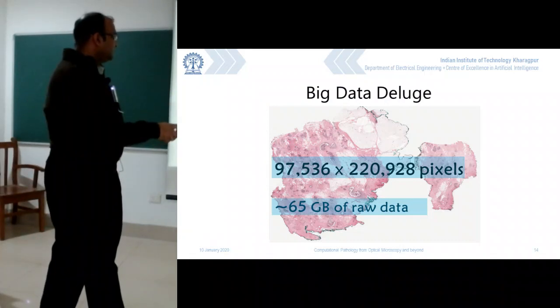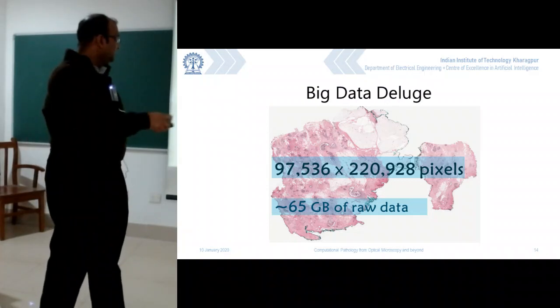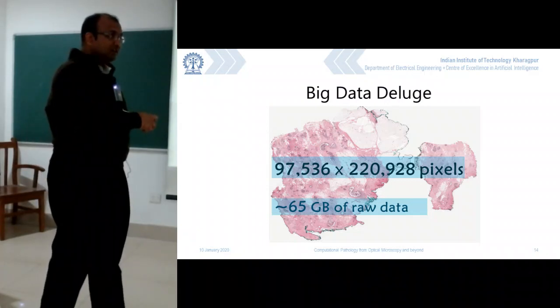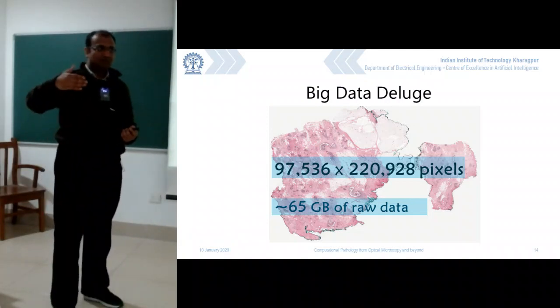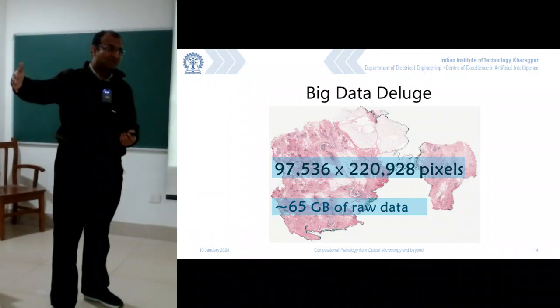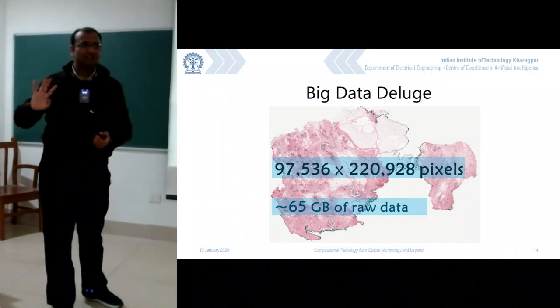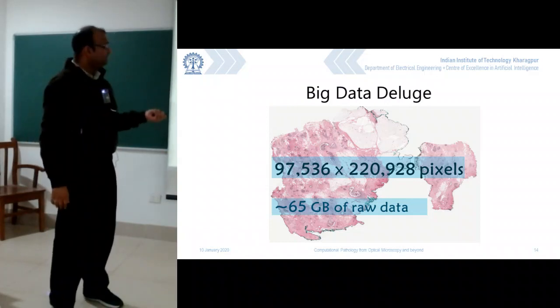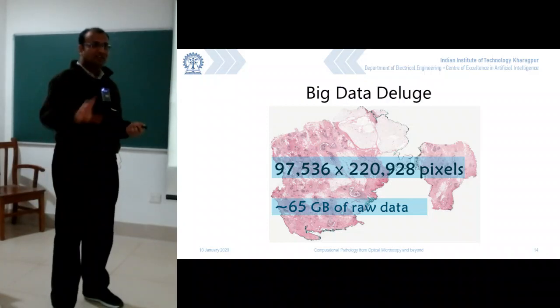I mean, we basically chop off all of these. In fact, there is no data stored corresponding to these white regions. So how it is stored over here to make it to 65 GB is not all pixels. So all relevant pixels over here are only stored. Everything else is a white space. So there is something which is called a MATTE, M-A-T-T-E, not a map. So what this matte does is it says whether there is something visible over here or everything is useless over here. It's a 0101 binary map over there. Now that binary map helps me in saving a lot of real estate, and then I can say that only these places are where there is something useful information, and then it behaves like a linked list.